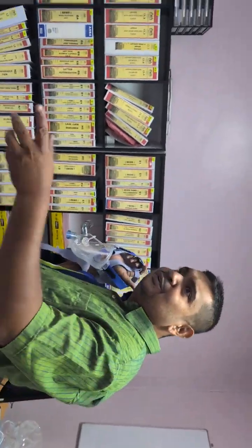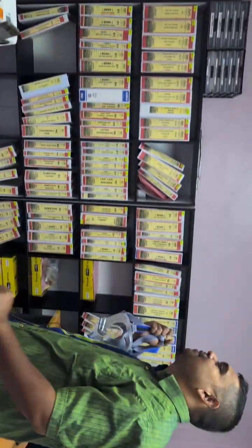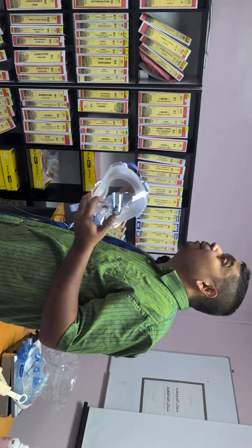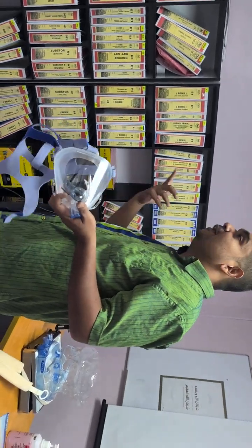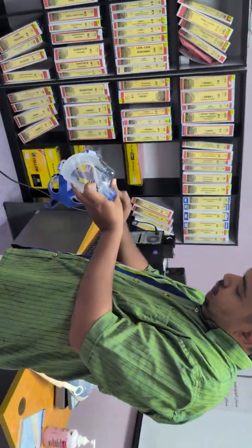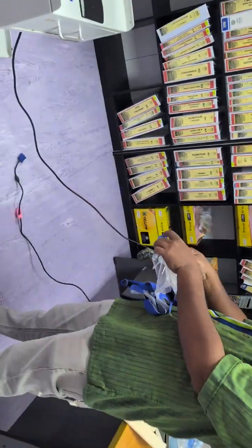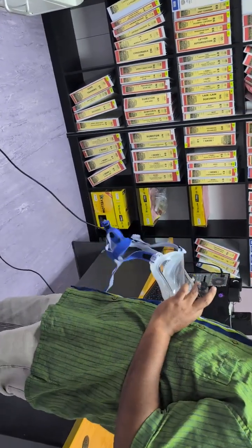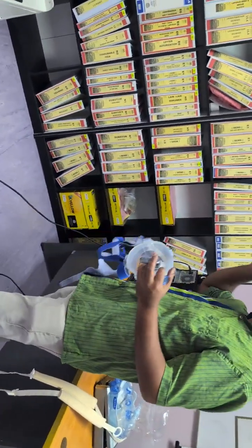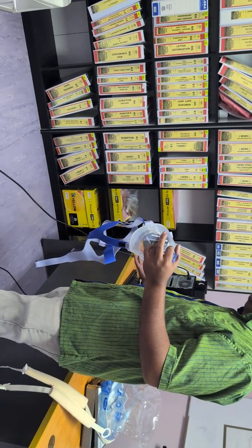This one, the patient is going to be on for a long time. So they're asking me, if you put plastic, when we pull it to make it tight, the patient is uncomfortable. So hence, they keep on telling me that this is still the best. So then I told them, if you can do it like this, at the ends, do it here too, and we just pull it. Okay, so they are considering that right now.